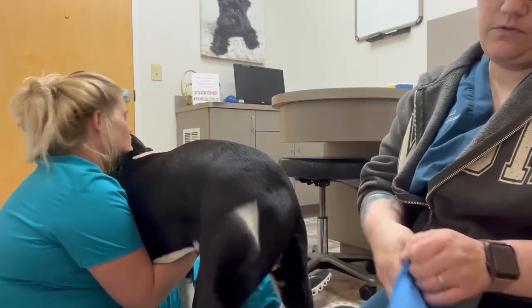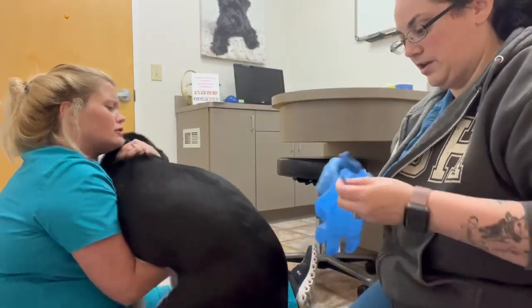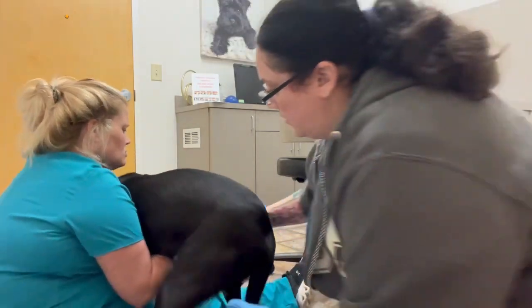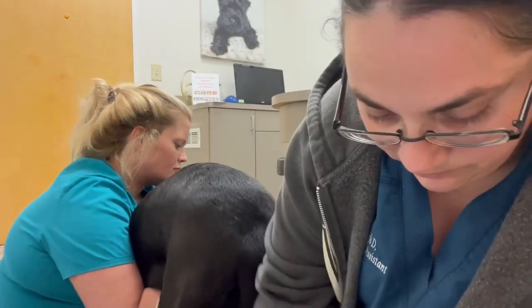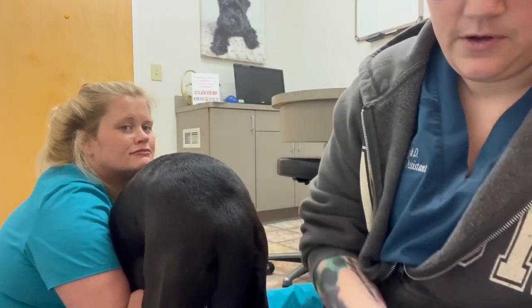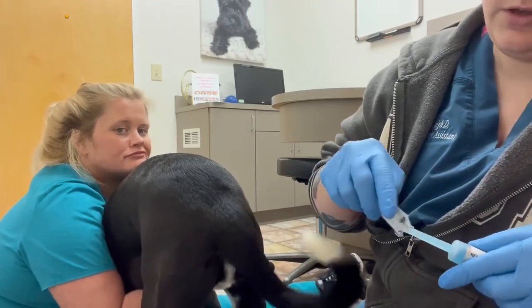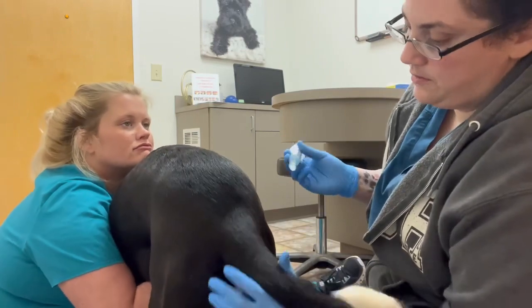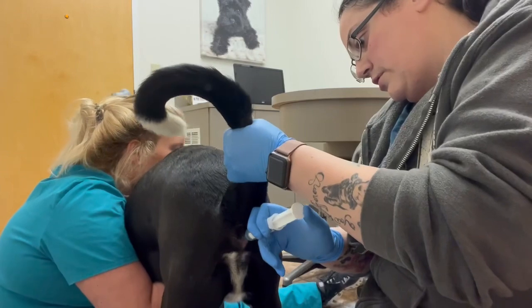I'm going to put on some gloves. Hold on Jax, it's okay. I'm going to lubricate the tip of the syringe, then I'm just going to insert and let the gel go by itself.